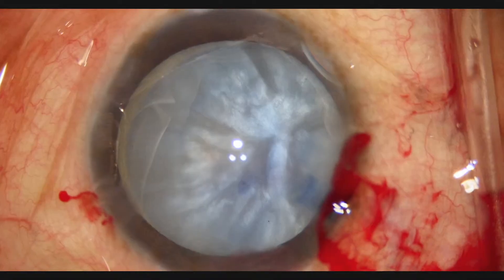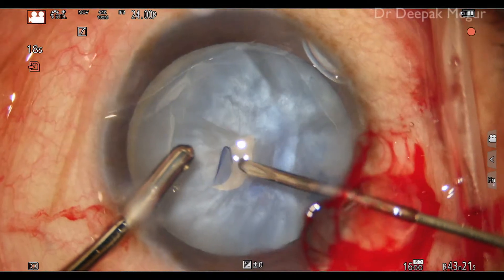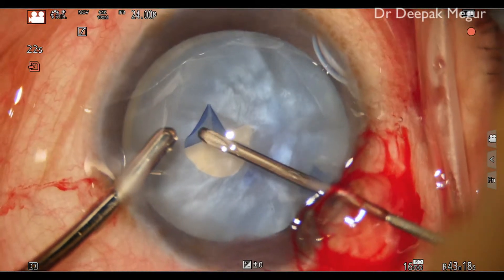Intumescent cataracts are a challenge for the phacosurgeon. The rhexis is quite difficult in these eyes owing to the high intralenticular pressure.